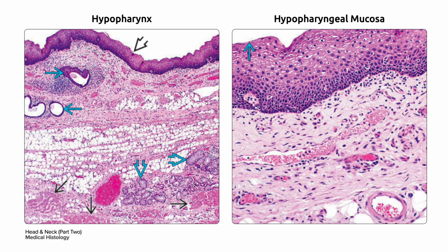On your right, although the surface typically consists of a non-keratinizing squamous mucosa in a single blue arrow, exposure to irritants such as tobacco smoke can result in surface keratosis.